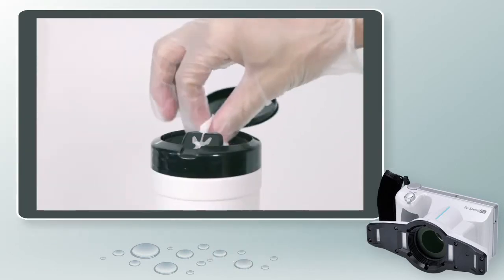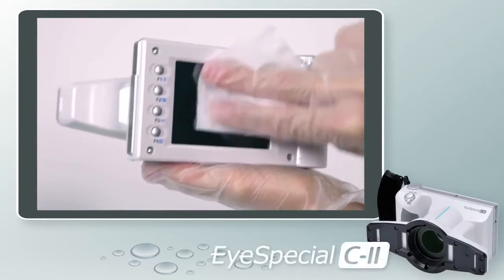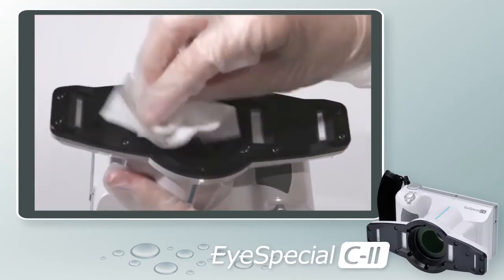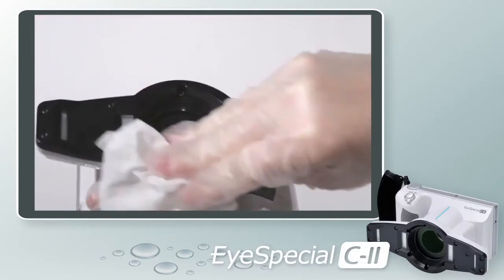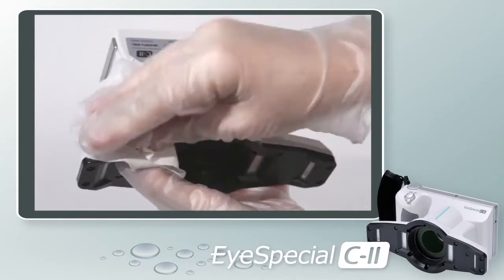Rugged and durable, the iSpecial C2 is scratch and scuff resistant, as well as water and chemical resistant, which is essential for infection control in the office. There is no need to wrap the camera as you would an SLR. Simply wipe the camera with a surface wipe and you are on to your next patient.